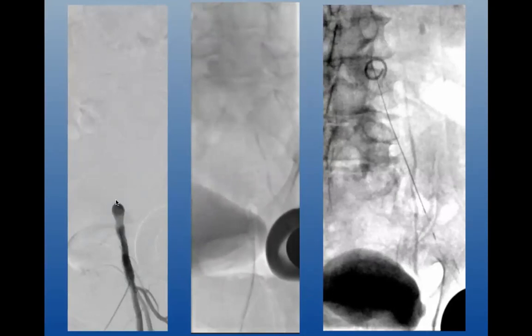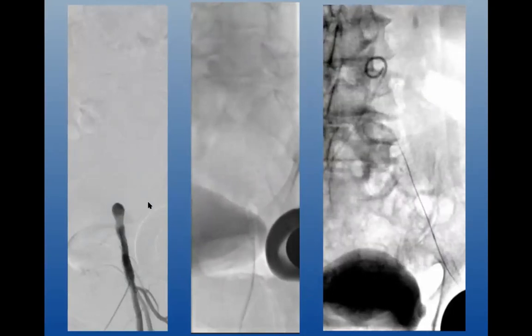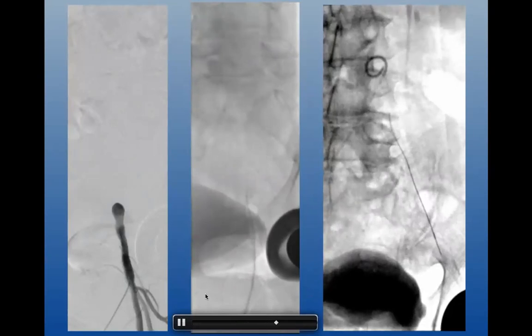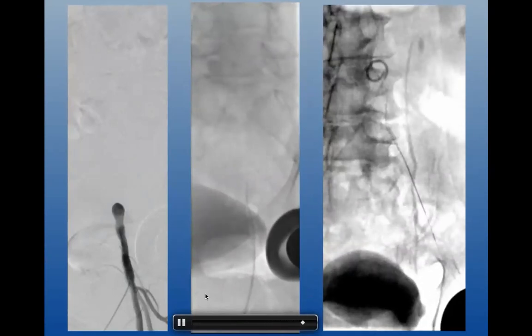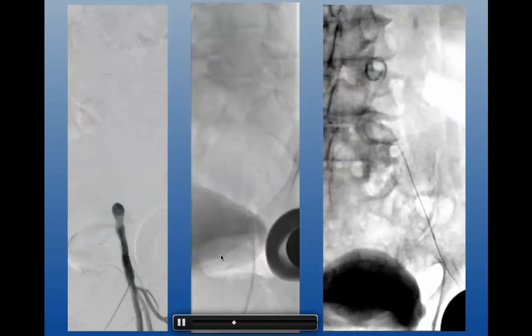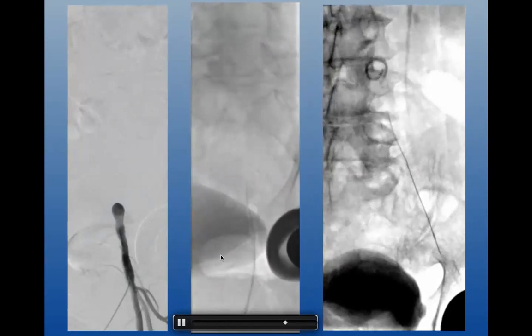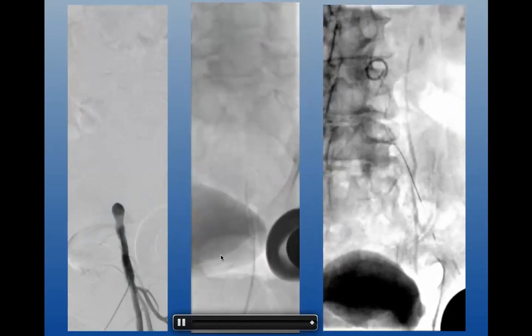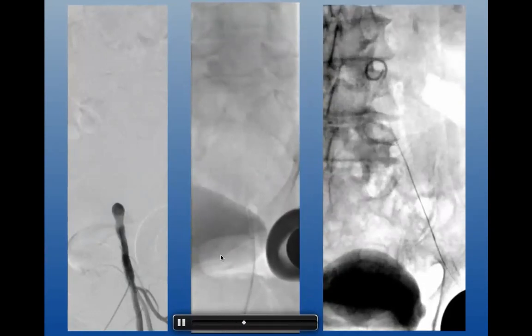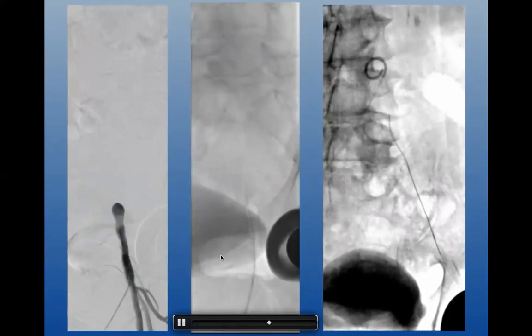Here's that cap I was talking about with a relatively favorable morphology. I want you to watch this here. So I'm using a Cook CXI CTO catheter. It's an 018 catheter. I have a CTO wire. We talked about tip load in the past. Tip load meaning how many grams of pressure to deflect that distal 1 centimeter of the wire 2 millimeters, right? So in this case, I'm using an Abbott 250T guide wire.